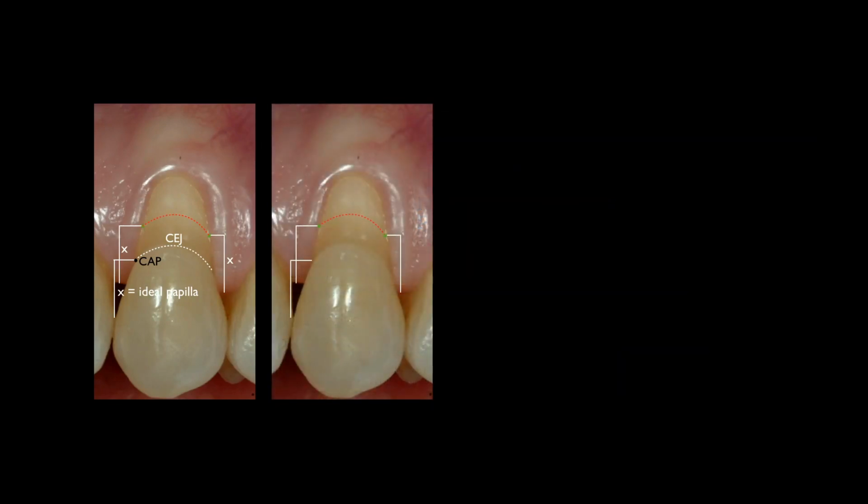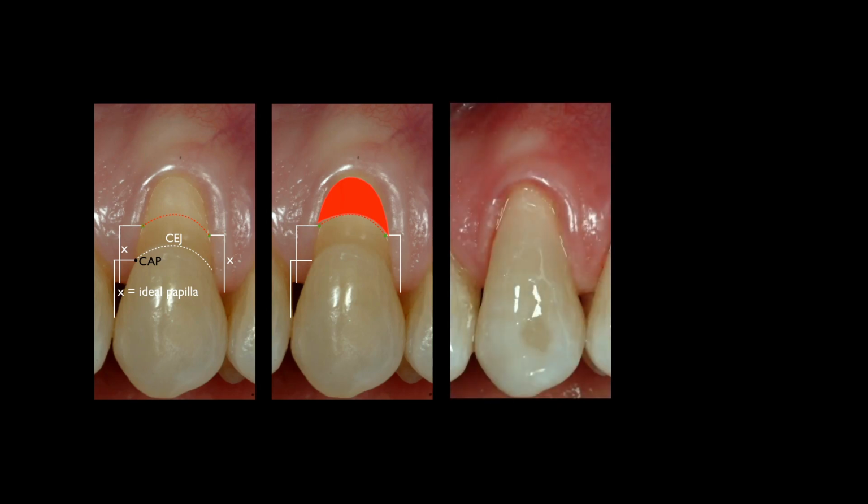And only the apical aspect to this line will be covered with the soft tissue. So the first thing we have to do is to use this apical aspect, to be covered with the soft tissue, for the clamp application, rubber dam isolation, and composite application in a very isolated operative field.